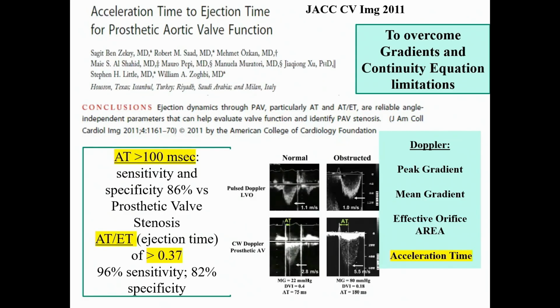Anyway, to overcome these gradients, approximately 10 years ago, the group by William Zoghbi asked us for a collaboration, and we clearly demonstrated that acceleration time may add a lot, both in absolute values, more than 100 milliseconds, or as acceleration time divided by ejection time.